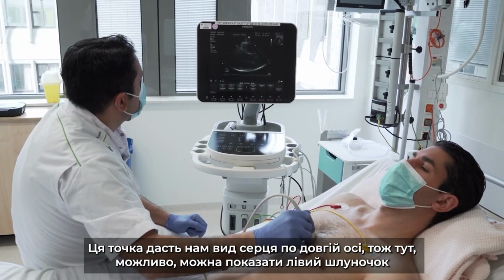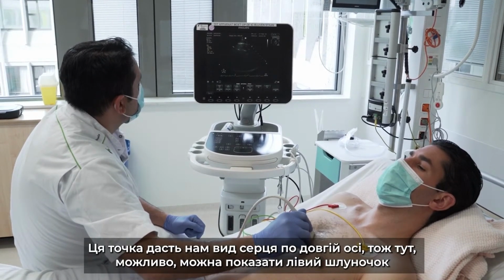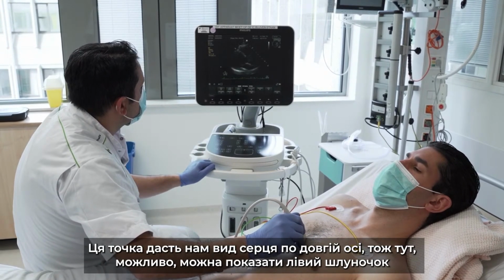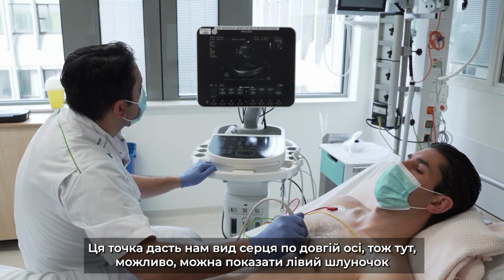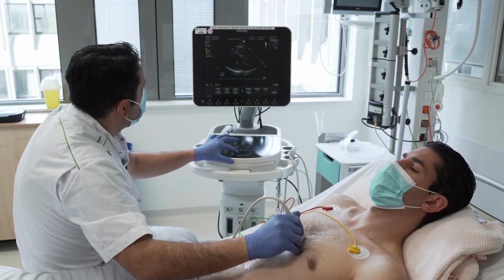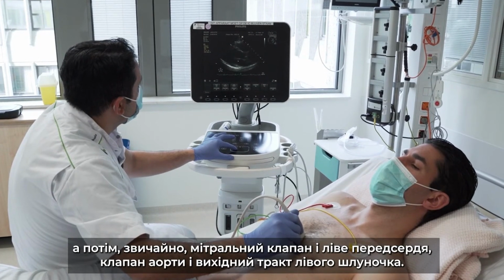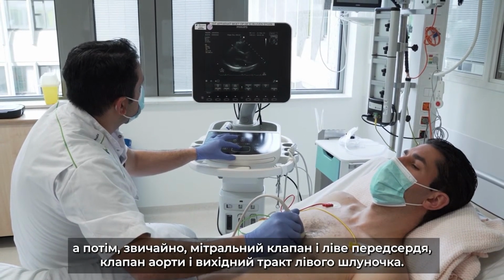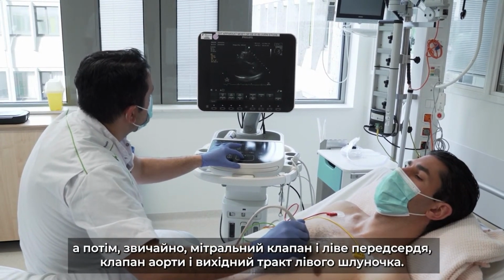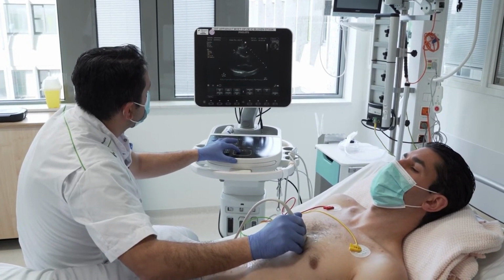This window will give us the long axis view of the heart. And Sakir, maybe you can show the left ventricle. And then, of course, the mitral valve and the left atrium, the aortic valve and the left ventricle outflow tract, and then on top of that, the right ventricle.